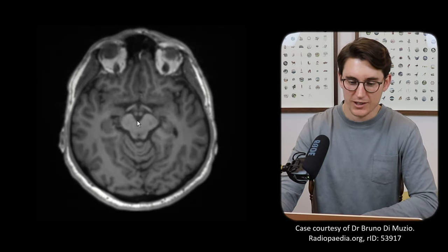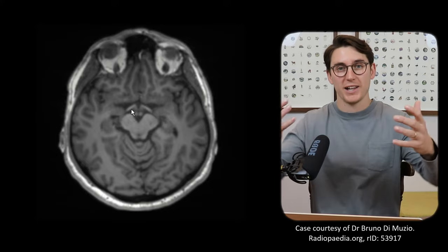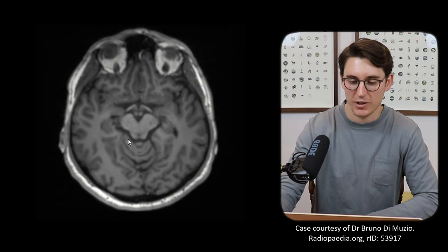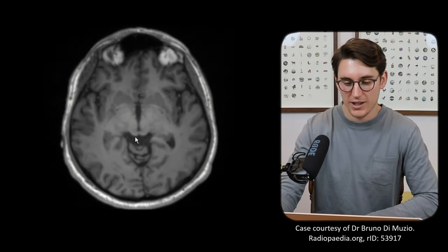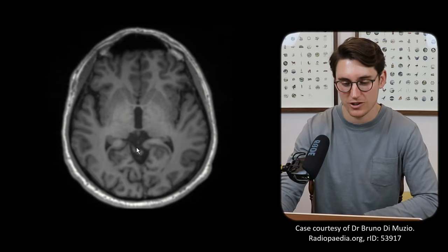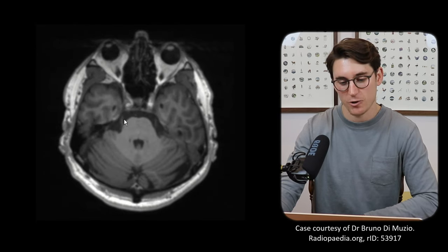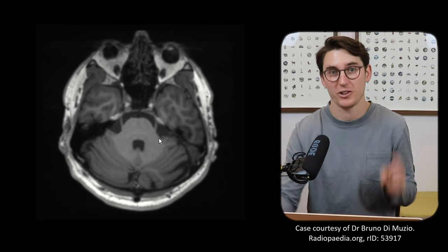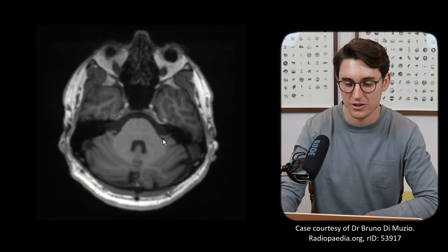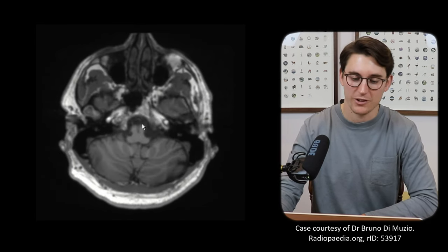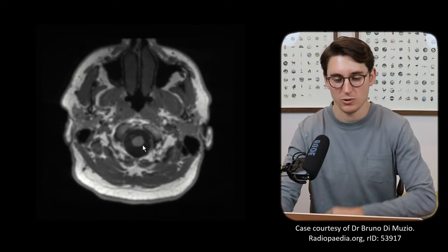Coming back up to the level of the midbrain, we can see our cerebral peduncles — so this is our interpeduncular cistern. Our ambient cistern surrounds the midbrain — like ambient temperature, surrounding temperature — coming across to our quadrigeminal cistern where we can see our superior colliculi and inferior colliculi below them. Posterior to that is our superior cerebellar cistern. Heading down into the pons, we can see our prepontine cistern and our cerebellopontine cistern — you can see our trigeminal nerve coming out there. If you don't know where those go, have a look at our skull base foramina video. Heading down into the medulla oblongata, we've got our premedullary cistern, our cerebellomedullary cistern, and then heading down into the cisterna magna at the bottom with our spinal cord heading further down.